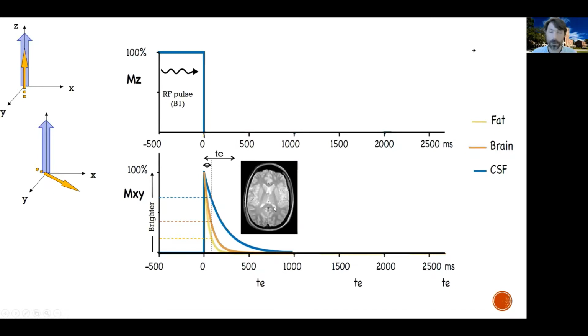These are the lateral ventricles, if you're not familiar with neuroanatomy. And I should say, I'll probably have a lecture on neuroanatomy for those of you who are not familiar with it. Brain, which is the second, the brown line right here. See, it's much brighter than before. Part of it is white matter, which is a little darker, and part of it is gray matter, which is a little brighter. And finally, fat out here, you can see it.